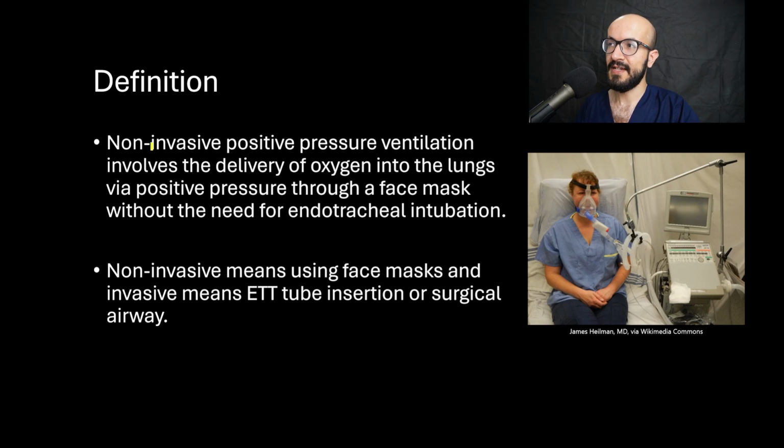Non-invasive positive pressure ventilation involves the delivery of oxygen into the lungs via positive pressure through a face mask without the need for endotracheal intubation. The whole idea of positive pressure ventilation is increasing the outside pressure to make it easier for the air to enter the lungs.